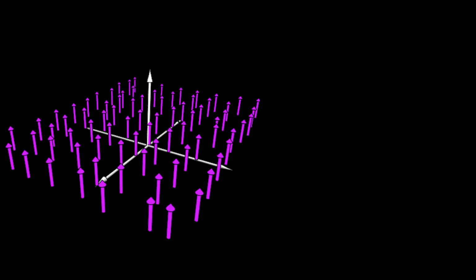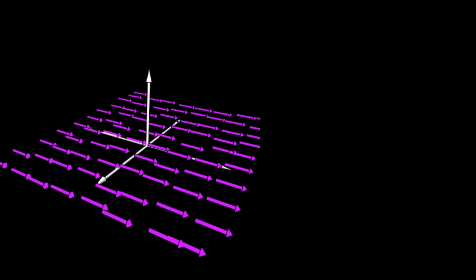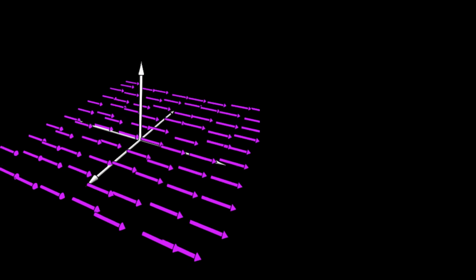Okay, let's deliver our B1 excitation magnetic field on the negative y-axis. So our spins then precess about the B1 field, and when they are perpendicular to the B0 field, i.e. at a 90-degree flip angle, we turn off the B1 field. Now the total magnetization of our spins is in the positive x direction of the transverse plane and thus delivering detectable signal. So let's think about the dynamics of their subsequent dephasing and T2 decay. I'll orient the camera so the magnetic field is coming out of the screen here, and I'll also add another vector here to represent the magnetic moment vector sum.